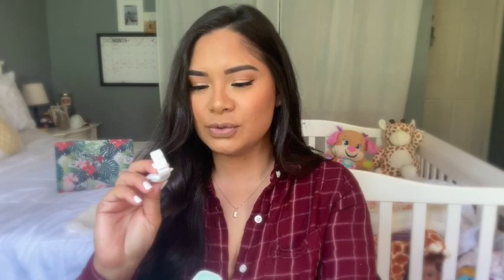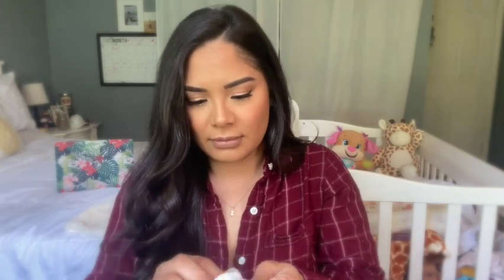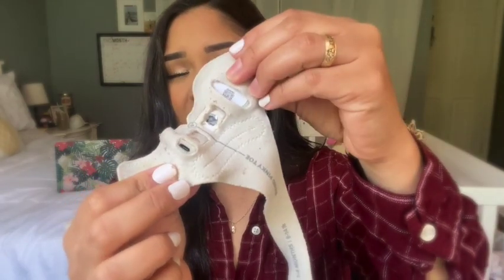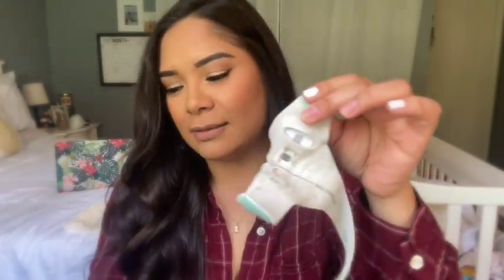What you do is put this little sensor inside the sock — like this. The sensor is blinking right now because it's not plugged in and the base isn't turned on. It also tracks sleep. When I first got my daughter home from the hospital, she was sleeping anywhere from 30 minutes to an hour and waking up every single hour.